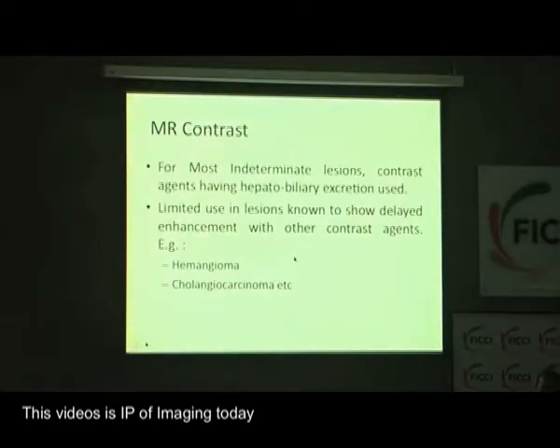This is something you need to be aware of when you are looking at patients with focal lesions, because the liver parenchyma tends to enhance sequentially after intravenous contrast. If you do use a hepatobiliary contrast, while the 60-minute image can be of use to distinguish some of the lesions, the problem actually comes in the immediate delayed sequences.